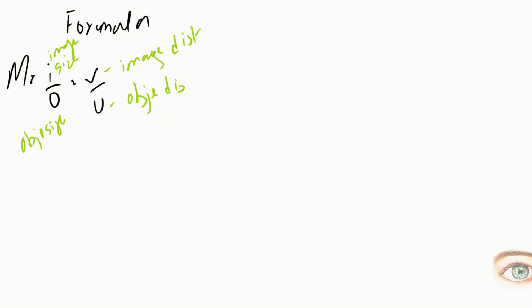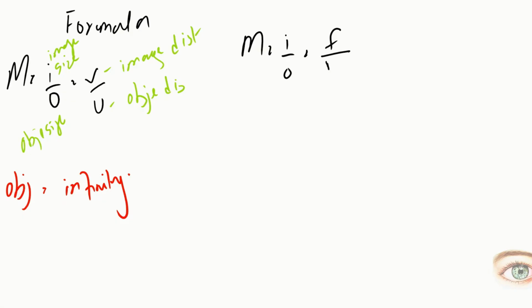Now, if we take that the object is at infinity, right? Now the formula will become m = I/O = F/U.